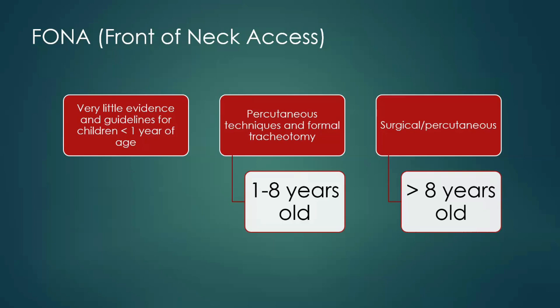But if you aren't familiar with the technique, rather don't use it because of the risks of causing injury and various forms of complications. Looking through various papers, websites, and FOAMEDs, there's actually very little evidence and guidelines for children under 1 year of age. I cannot give you a straightforward answer as to what is going to be your ideal front of neck access in these cases.